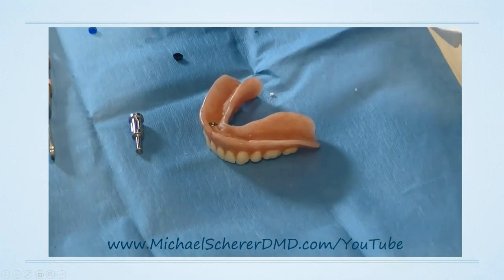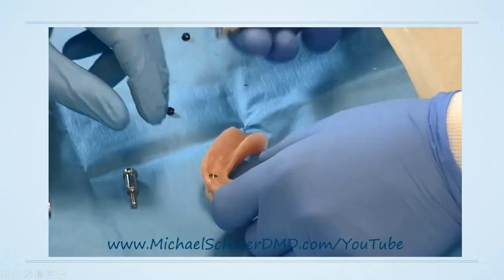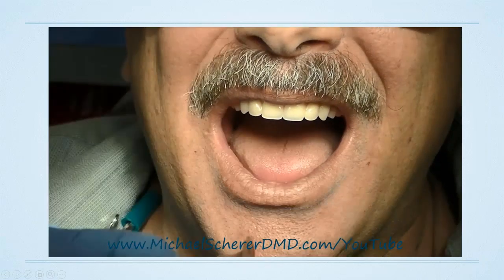Now at this point, I can use my locator core tool, remove my black processing insert, and place my nylon retentive insert. And most of the time, I start out with the blue or the lightest possible insert for my patient.